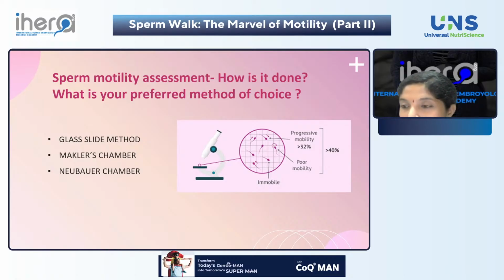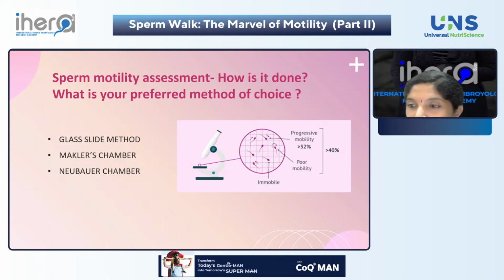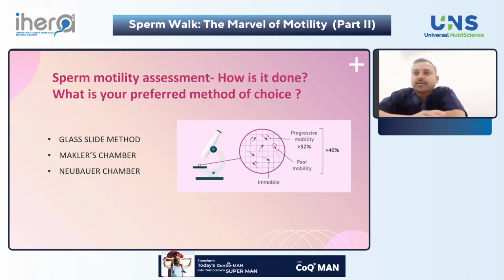About motility, we are counting those spermatozoa which are going very forward in direction, those sperm considered as forward progressive type A. No, sir, that is about grading. We just want to know about the counting in the Makler chamber, the motility assessment. So in the motility, how many? Minimum 3 rows we are counting, adding the total motile sperm and dividing by the total number of spermatozoa counted, which equals the percent of motile in forward progressive. In such a manner, we are counting all of these factors.